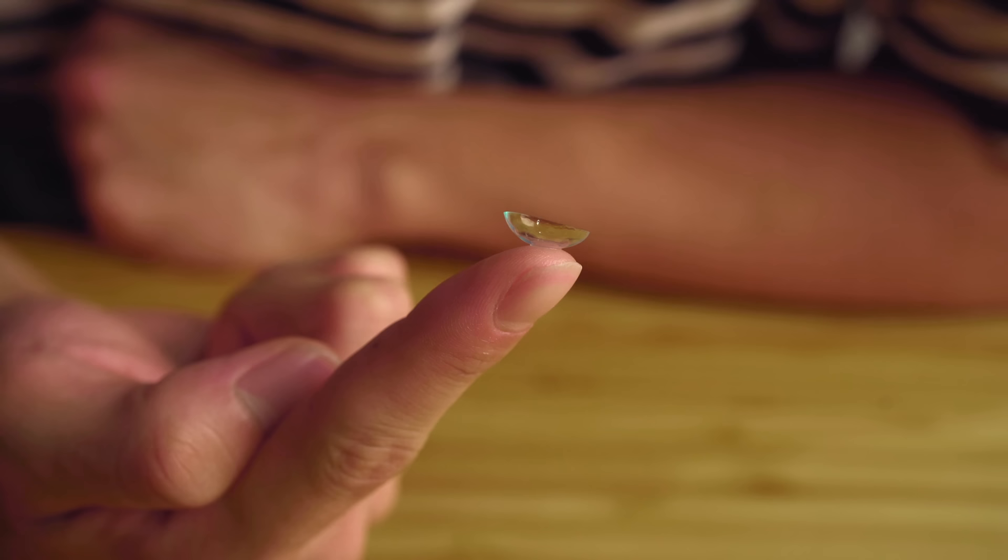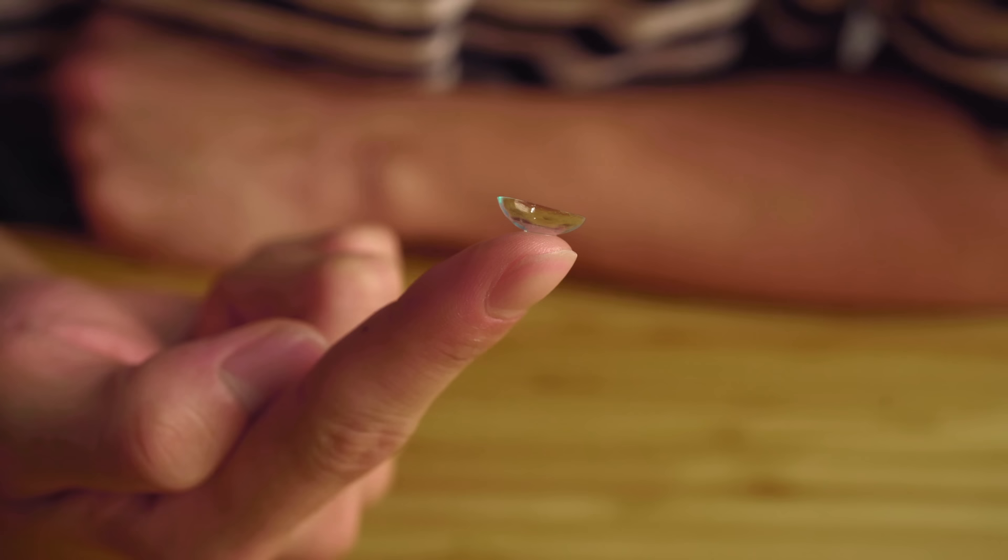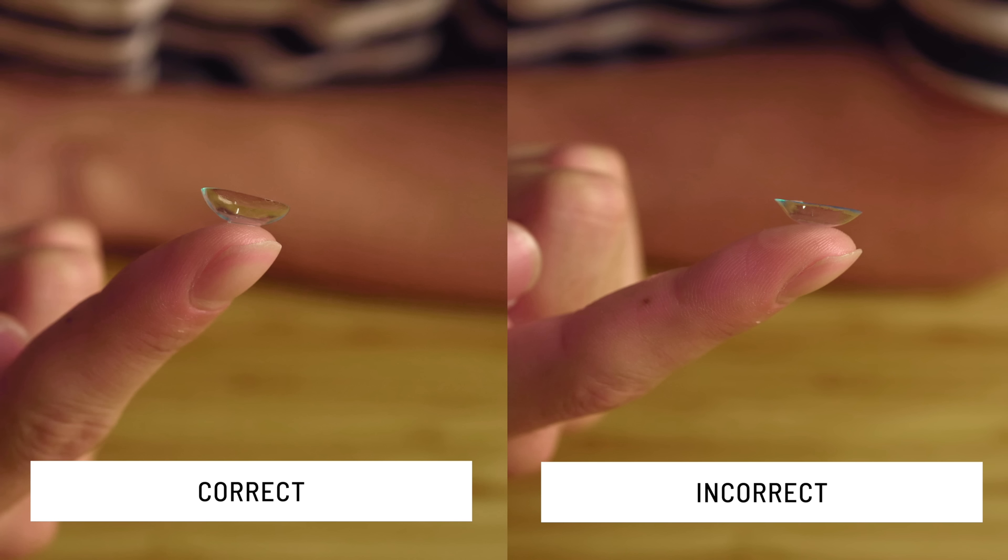Position the lens at eye level and inspect the lens. There are two different ways your contacts can be positioned. The correct way should be for it to resemble a bowl shape where the lens points upwards. The incorrect way would be for it to resemble a taco where the lens either folds inwards or the lens points outwards.